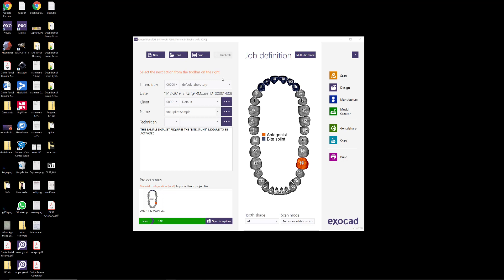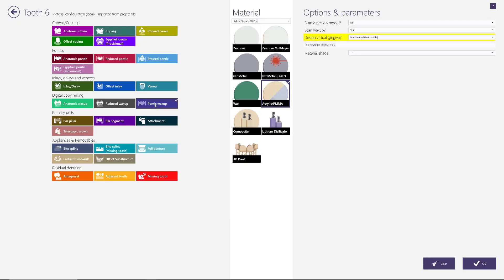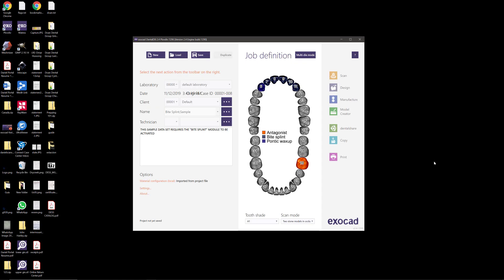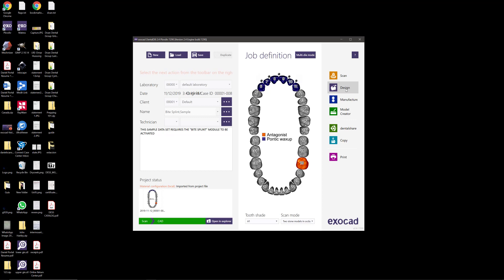To show these tools I'm going to use the Bisplint demo case and modify it to what I need. Let's pretend we're going to do the front six. I'll change the restoration type from Bisplint to Pontic Wax Up and make sure the software knows I'm designing the wax up digitally. I'll apply it to all the teeth, click save, and jump into the design.